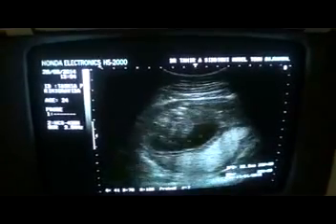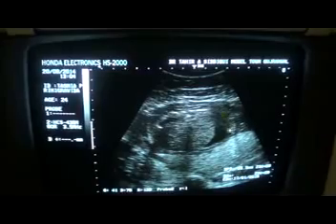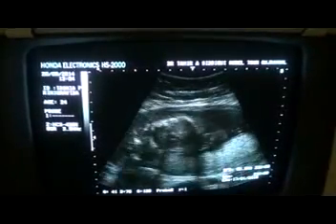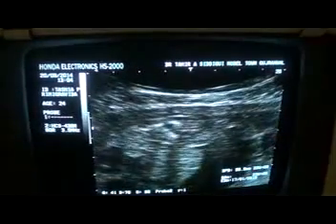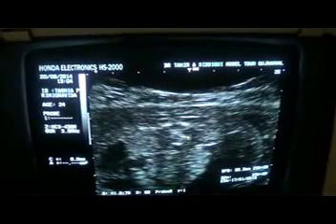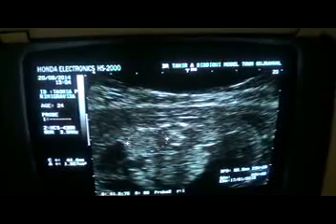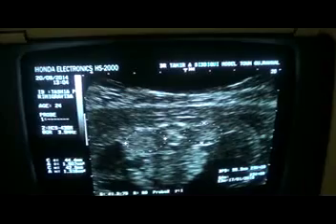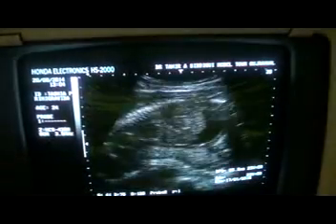Now this is the transverse of the abdomen, where we are able to see ascites. This is all ascitic fluid in the abdominal cavity, and here you see there are two kidneys seen. This is kidney number 1, kidney number 2 in transverse section, with vertebra in the center. And this is the second kidney. This is the vertebra. Fetal ascites.